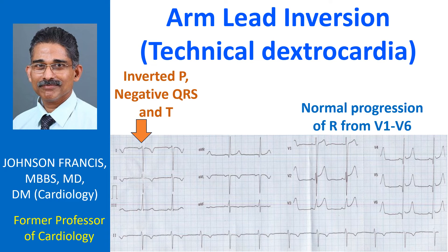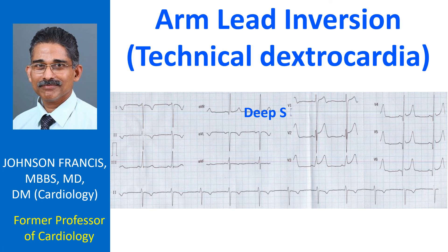This ECG also shows narrow Q waves and prominent T waves in lateral leads with mild concave upwards ST segment elevation. The S waves in lead V1 are deep and the R waves in V6 are tall, possibly evidence of left ventricular hypertrophy by voltage criteria.